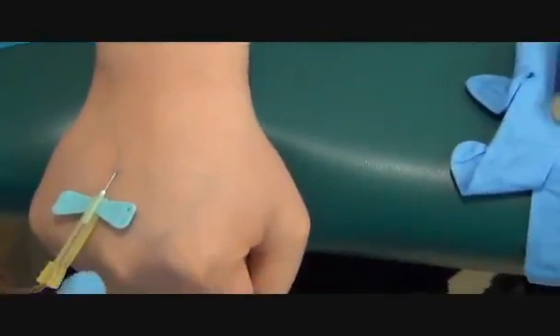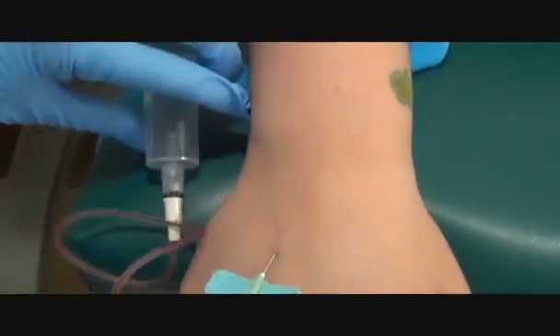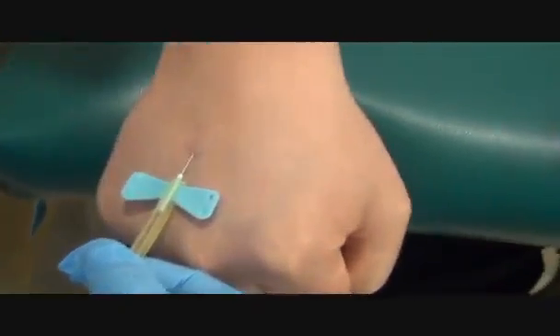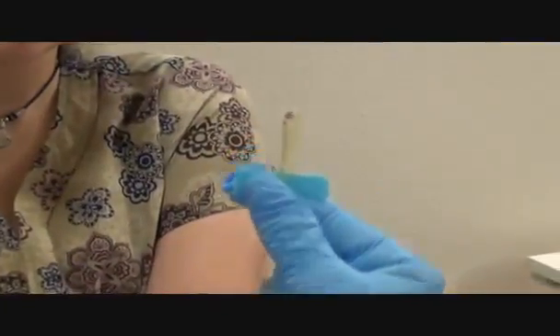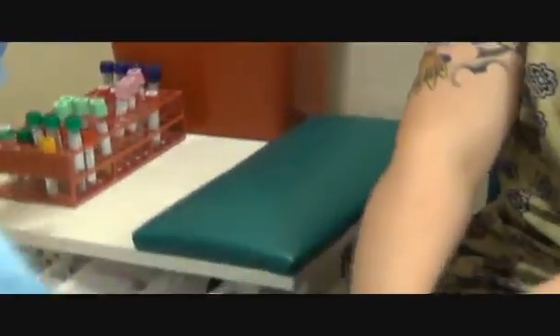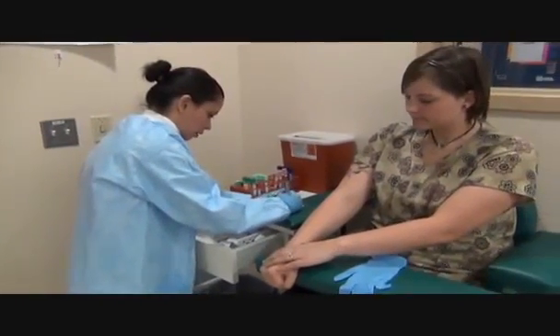So now I'm going to grab the base of this butterfly. I'm going to put down my hub. There's not enough space so I have to just let it hang. And I'm going to pull out. Apply pressure. I want to wrap the tubing in my fingers, and while I do that I'm going to pull down and push up on the safety device, activating it. Please apply pressure. I'm going to discard the needle.